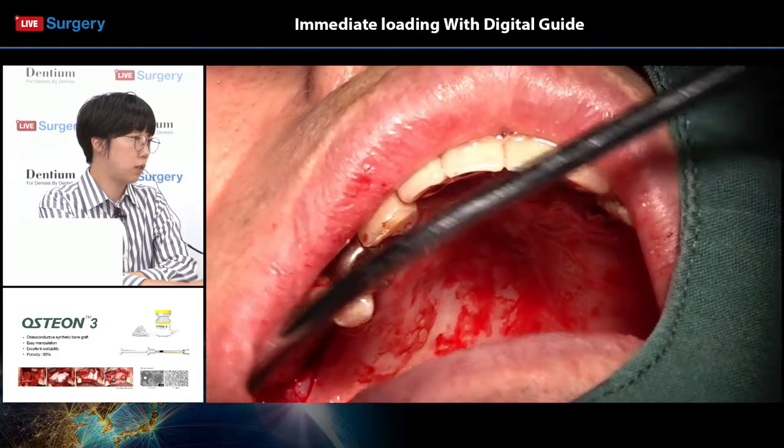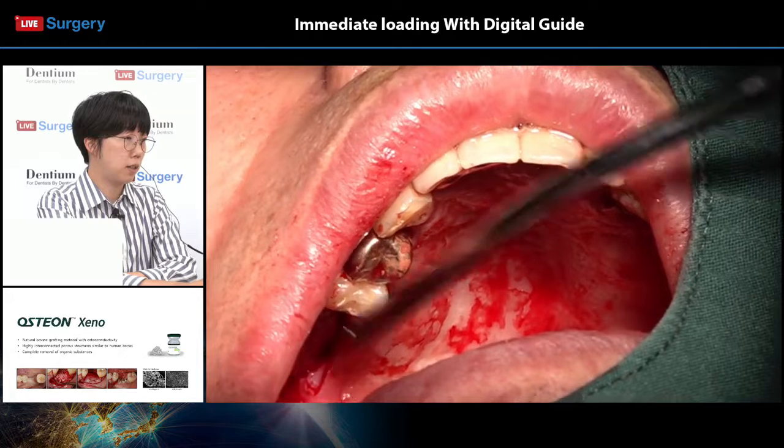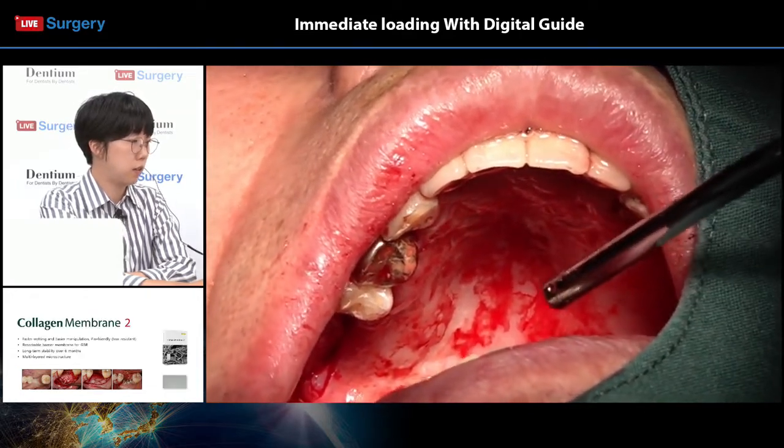I think Dr. Lee is now checking on the temporary abutments and the temporary crown for the tooth number 16 and 17 areas.